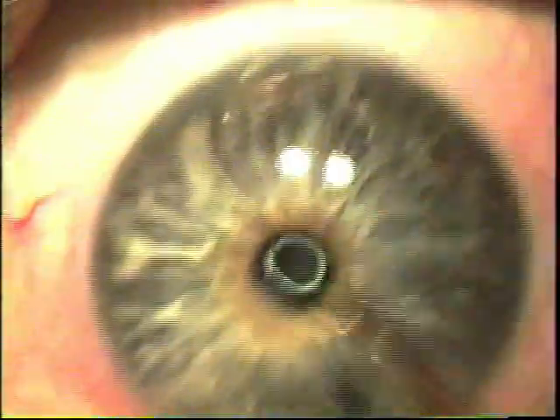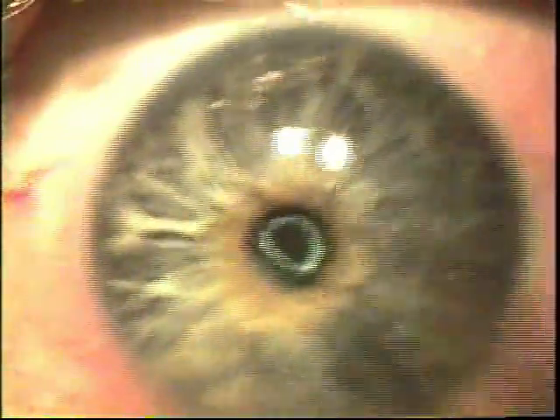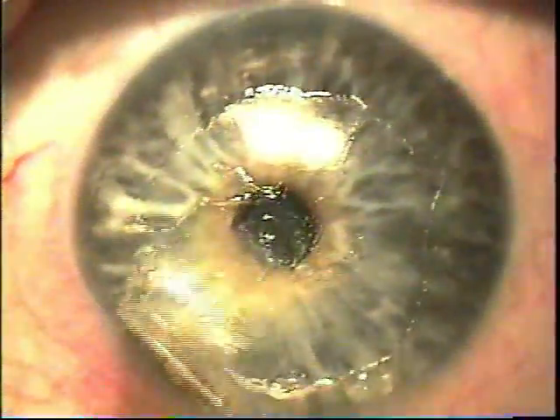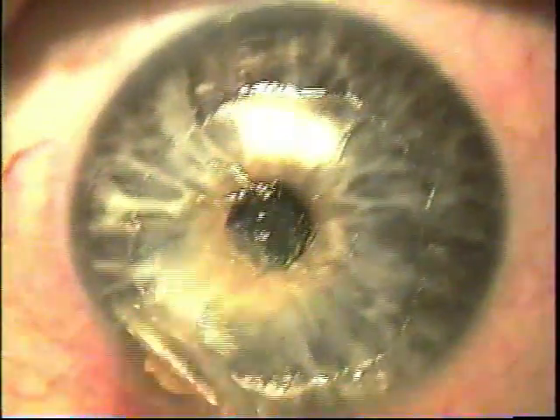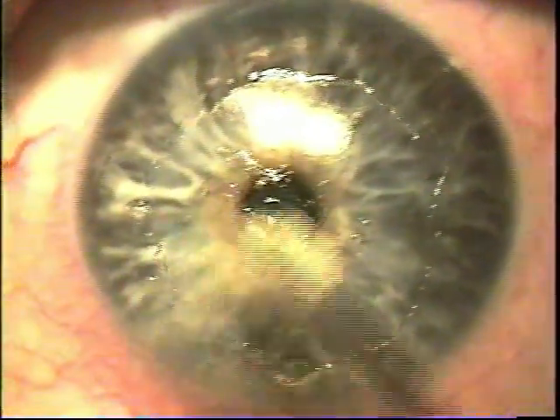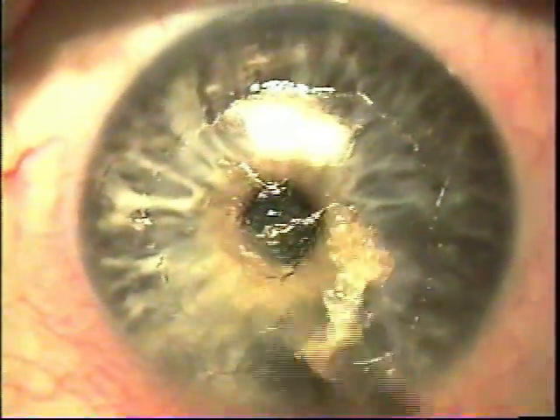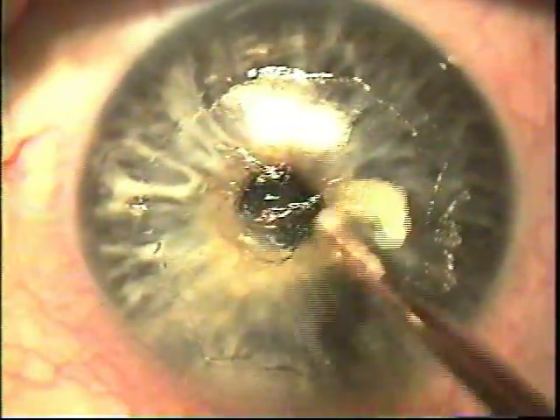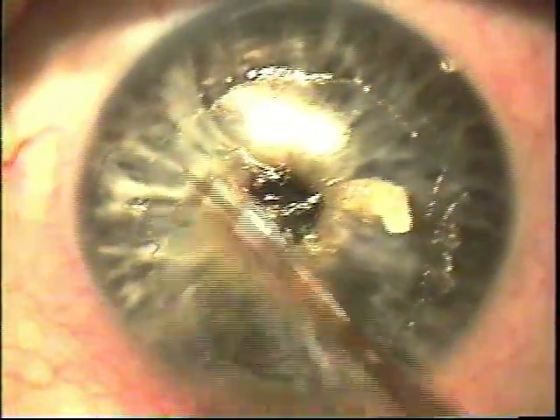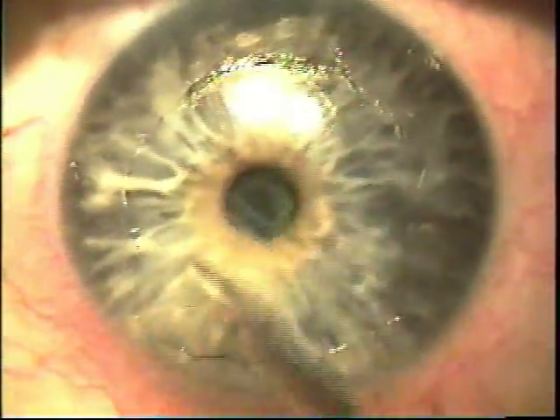Notice the circular light reflex here is D-shaped due to high astigmatism with fast movements. Take off the epithelium except in the area of the scar, leaving that for last, following my corneoplastic principles. Herpetic scars usually become part of the cornea, so you'll see a smooth surface at this point.